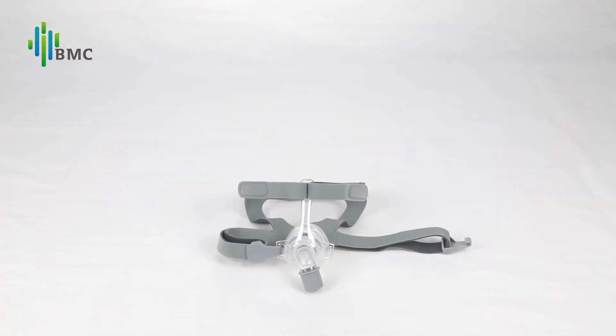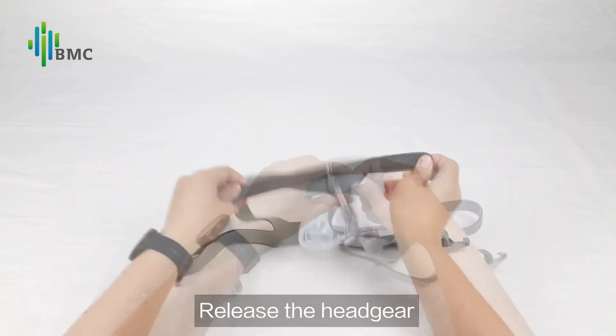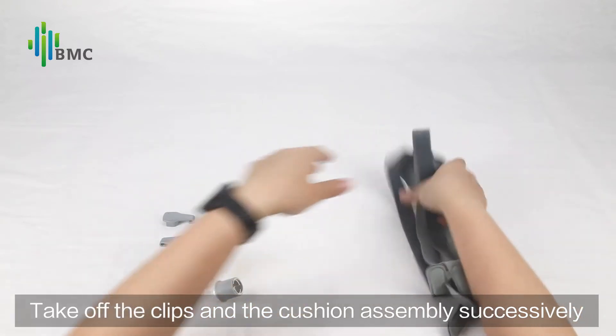Mask Disassembly: Separate the clips from the mask. Release the headgear. Take off the clips and the cushion assembly successively.